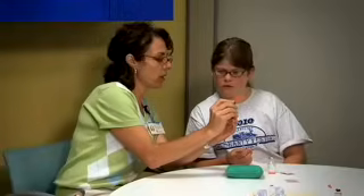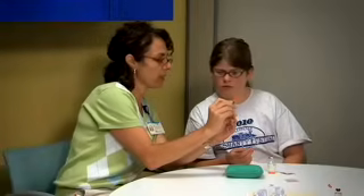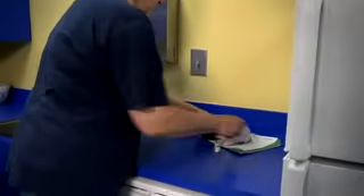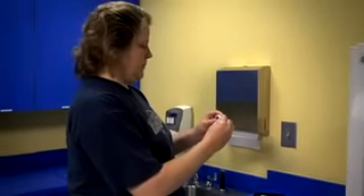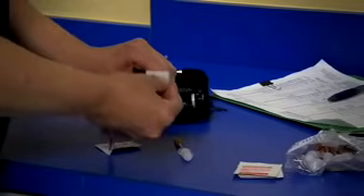Learning to draw up insulin from the bottle takes practice. Your nurse and a diabetes educator will help you learn. To draw up insulin, use a clean, flat surface to place your insulin, syringe, and other supplies. Wash your hands with soap and water. Check the label to make sure the insulin has not spoiled, expired, or been opened longer than 28 days. Wipe the top of the insulin bottle with an alcohol swab.